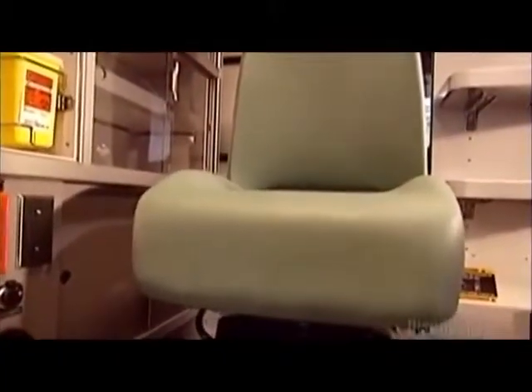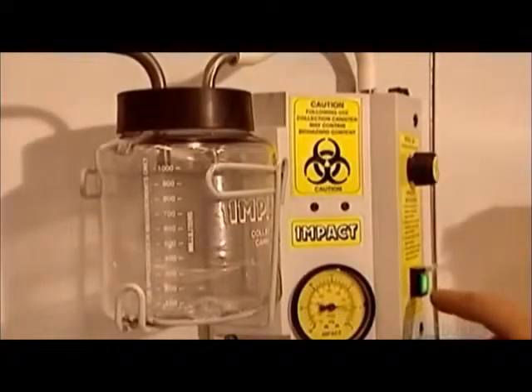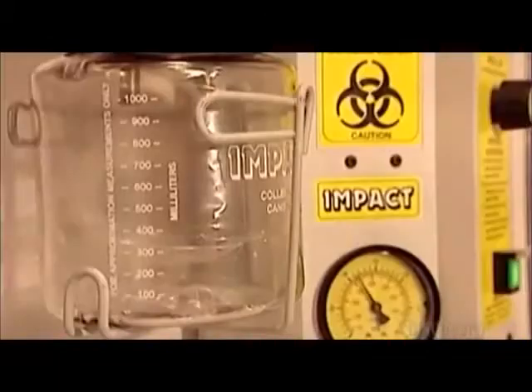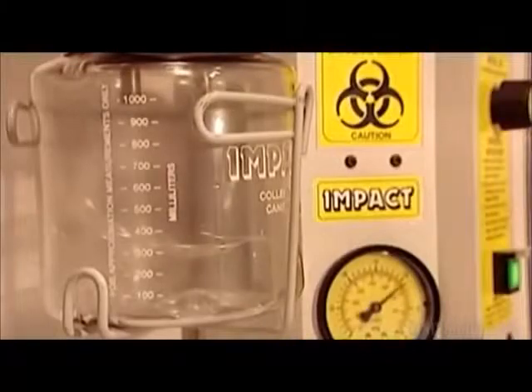This ambulance model has rotating lights. The red cover, called the lens, is made of virtually unbreakable plastic so that it doesn't crack from the air pressure when the ambulance is speeding. The medical area has a swivel chair positioned where the patient's head will be. Within reach of the chair, the suction machine. The factory thoroughly tests it, along with all other medical equipment.